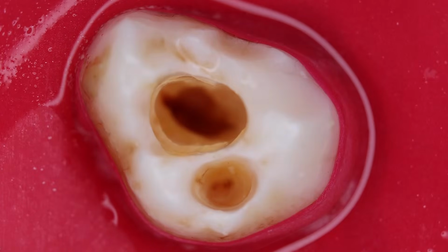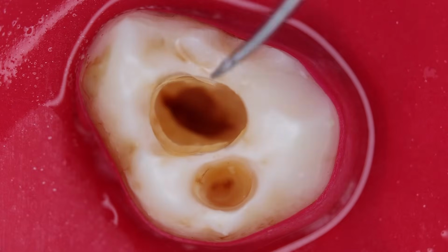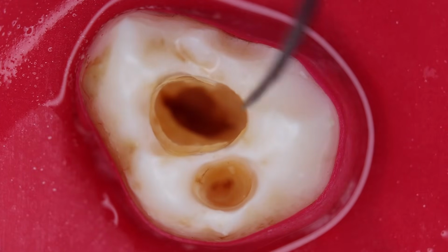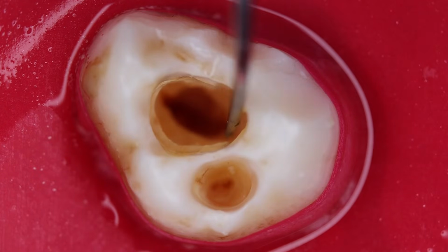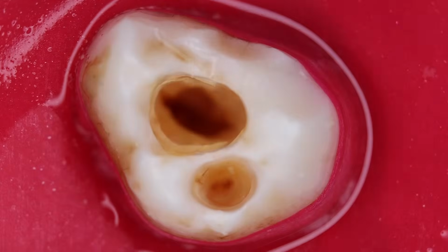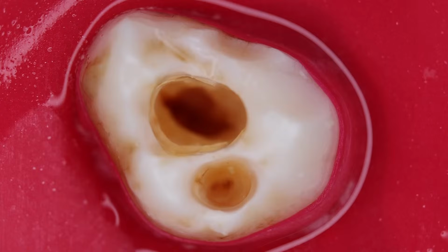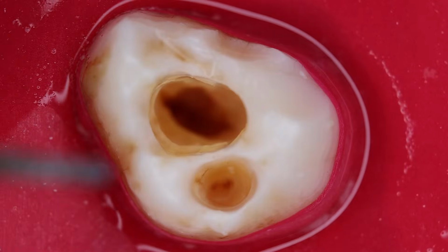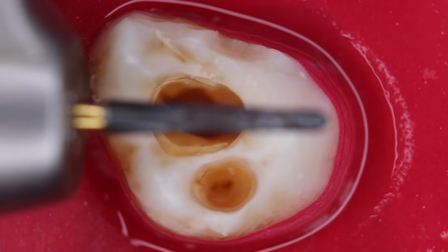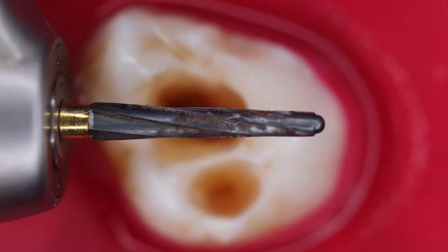Now you are seeing these overhanging margins on the walls, as you can see over here. So this is the time you need a bur that would not perforate the access cavity and would refine this shape. So we would now switch to the endo access bur from the round diamond point. So this is our endo access bur.